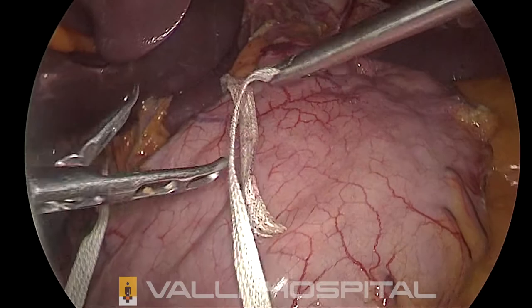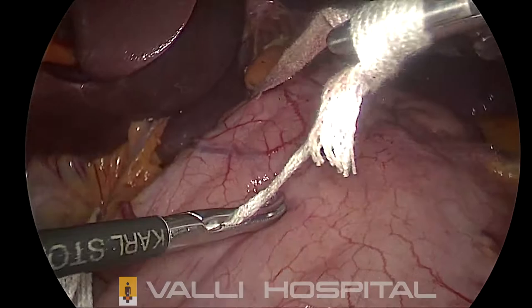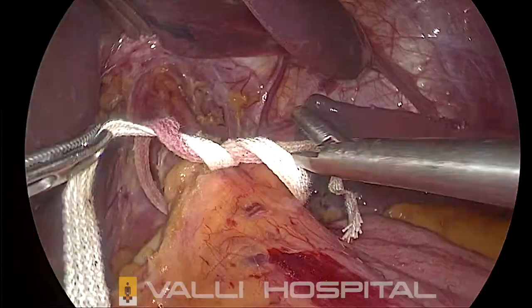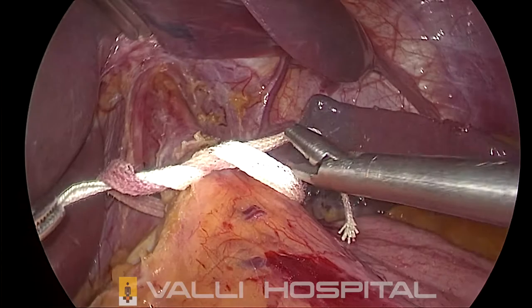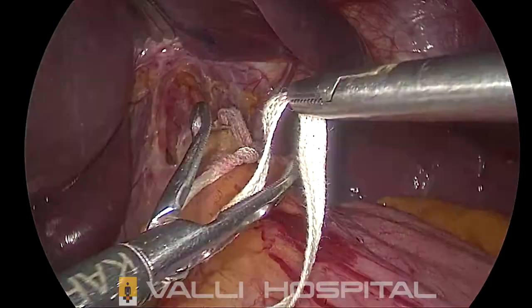Take enough thread. Don't keep a shorter thread and then struggle. Take a longer tape and then tie it exactly at the OG junction. Take it nicely at the OG junction. Tight. Don't strangle it. Keep a little bit of gap between the knot and the esophagus.